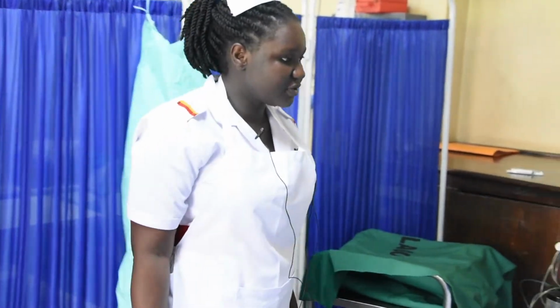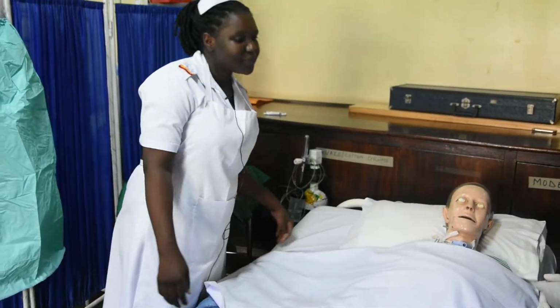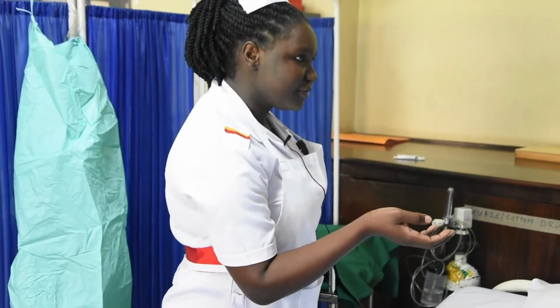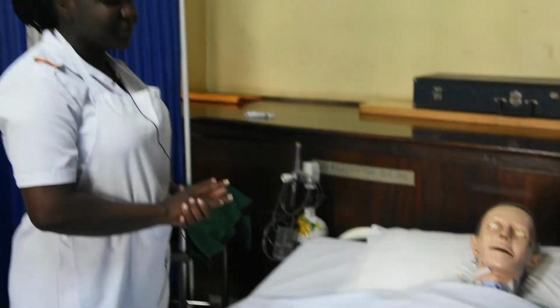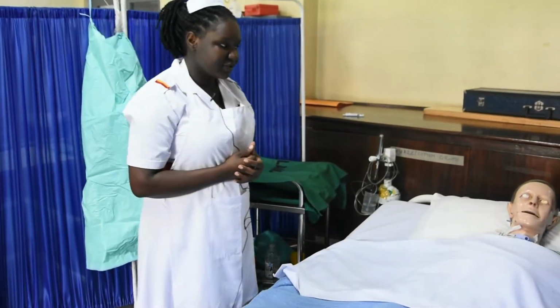Before us is a patient who is due for tracheostomy care and change. By the names, I'm Safinah from Mulago School of Nursing & Midwifery, together with my assistant. You're most welcome. So before us is a patient, as I've told you, due for tracheostomy care.